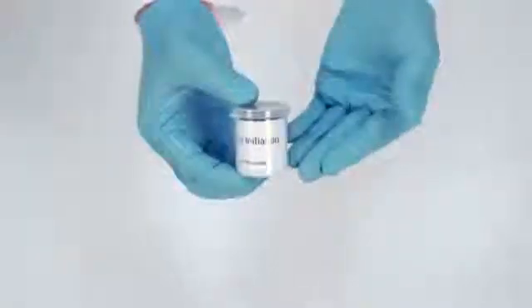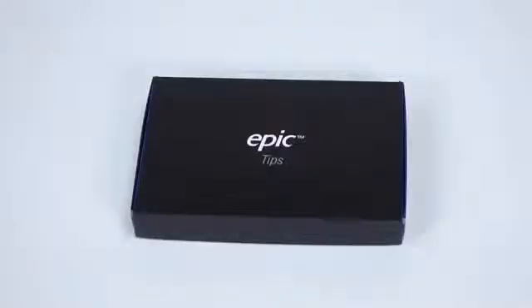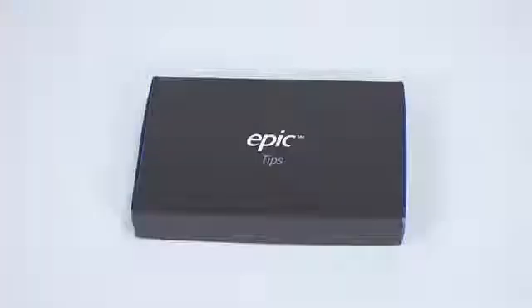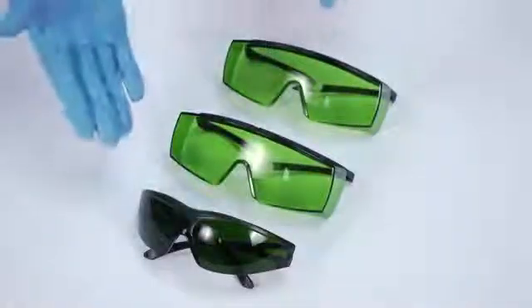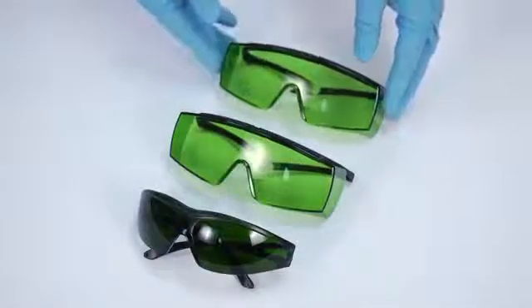Also in the top layer: a tip initiation kit, a box of EPIC disposable single-user laser tips, and a box for your EPIC delivery system.